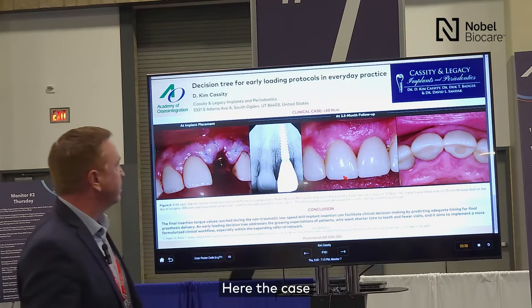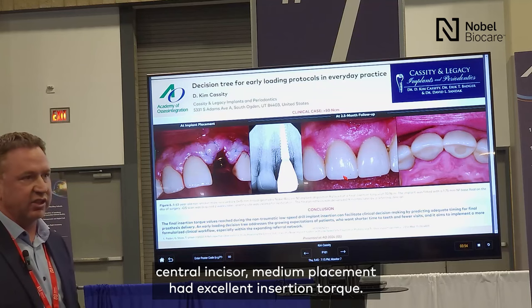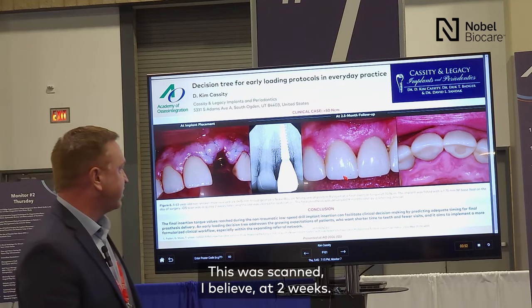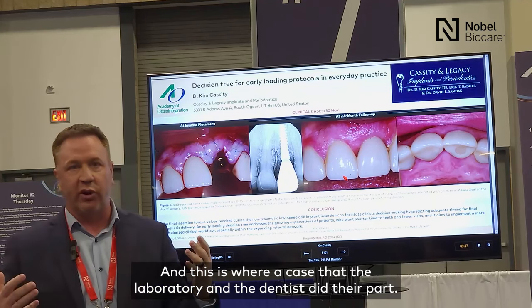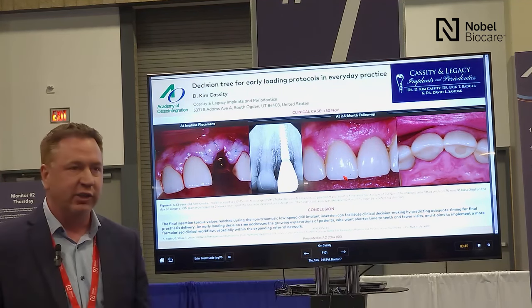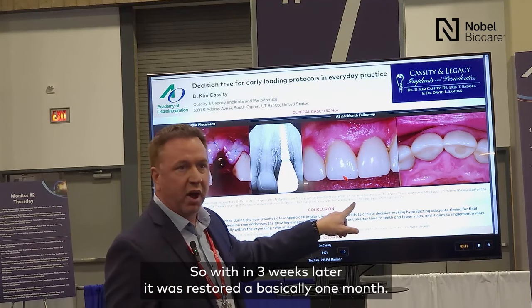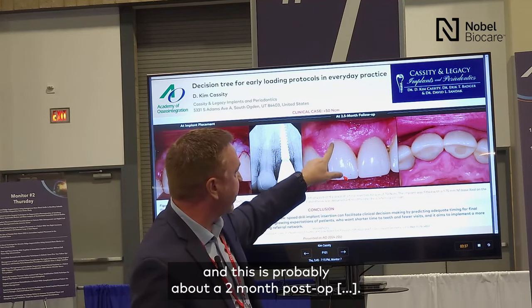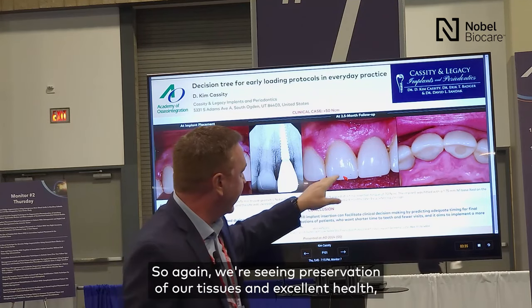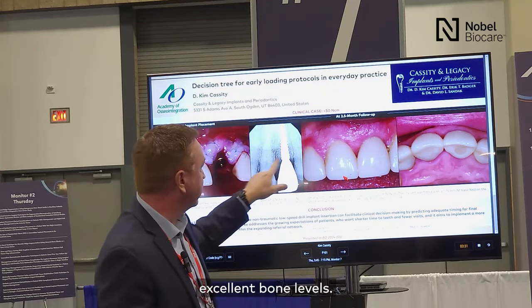Here's a case — central incisor, immediate placement, with excellent insertion torque. This was scanned at two weeks. The laboratory and the dentist did their part quickly, and it was restored at basically one month. Showing the final restoration — this is approximately a two-month post-op film. Again, we're seeing preservation of our tissues, excellent health, and excellent bone levels.